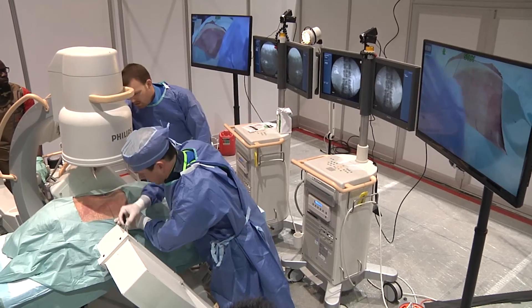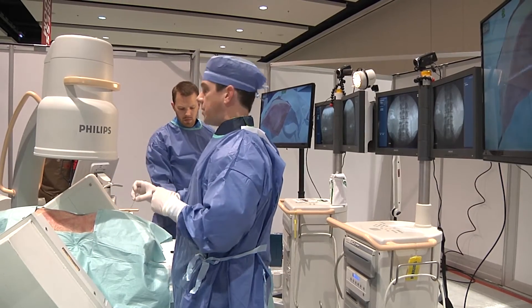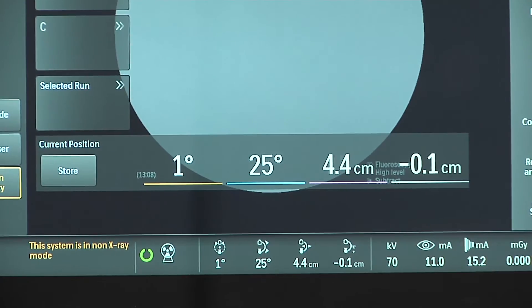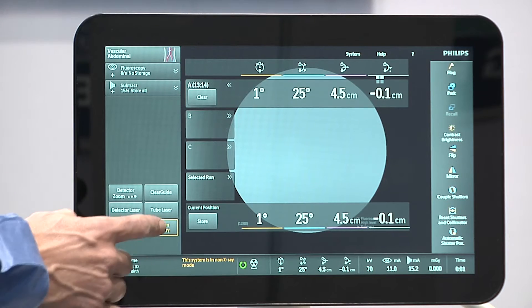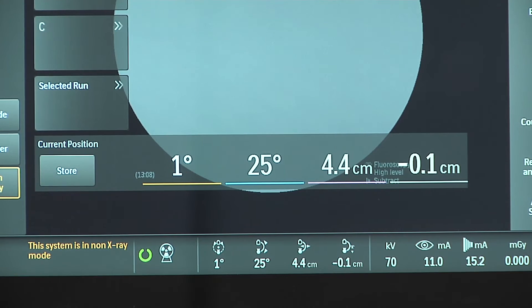The feature I like best is probably the position memory. Most of the time the patient isn't always oriented in a true lateral or anterior-posterior position, which is what a lot of doctors like to see for specific anatomical landmarks. Being able to take the guesswork out of it and just go right back to where the machine remembers it was based on my storage is a huge time saver.